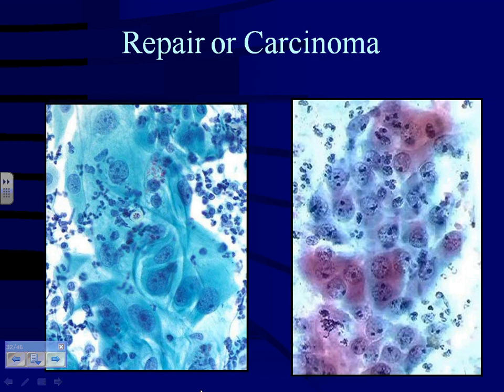And you're thinking, how do I know that? Well, first of all, if you look at these, notice how these cells have abundant cytoplasm, which is a good finding, okay? The nuclei are not showing that much overlapping. If you look at each nucleus, even though they're enlarged, they still look very uniform. The chromatin distribution is uniform. There are occasional nucleoli, which I would expect to see, and you see good cell borders. And it looks like they're maintaining a polarity with each other.